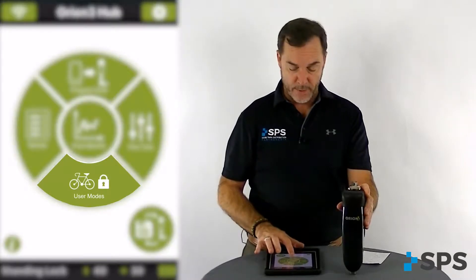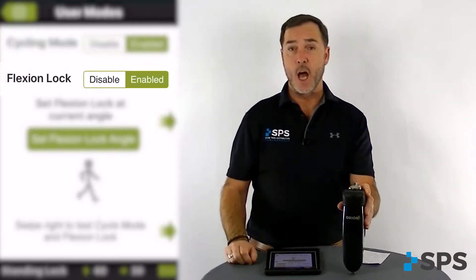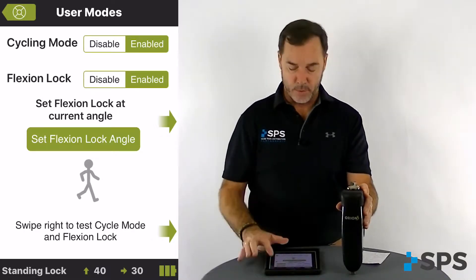From your hub on your Orion 3 app, press user modes and that'll bring up your cycling mode and your flexion lock mode. From this screen we can enable both of those functions. Factory setting is disabled, so you can see they're actually enabled.